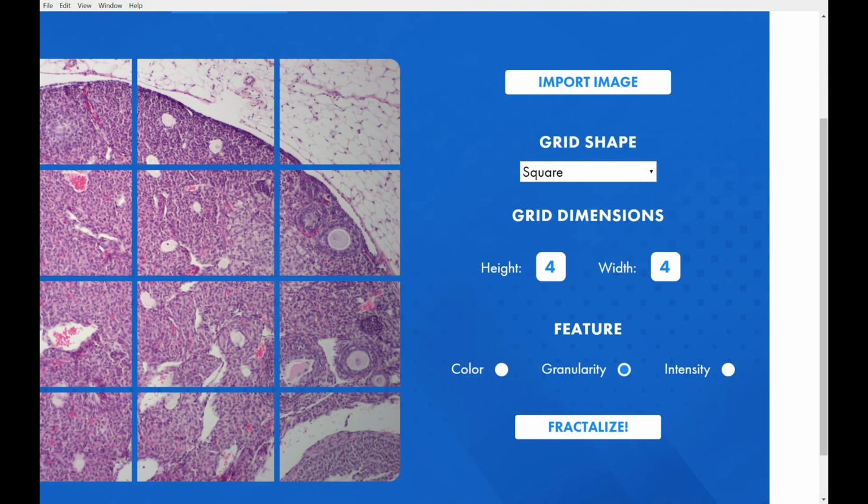Features are extracted by using a predefined color library, which calculates the percentage of those predefined colors which are selected in the GUI. In this example, we have a histology image where the only colors of interest are broadly dark purple and dark pink. Similarly to preprocessing, the color library is defined using the HSV color space.